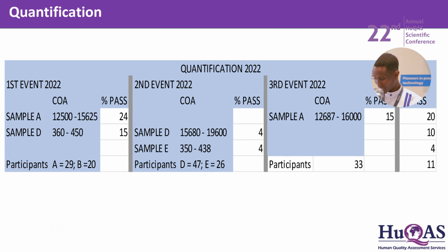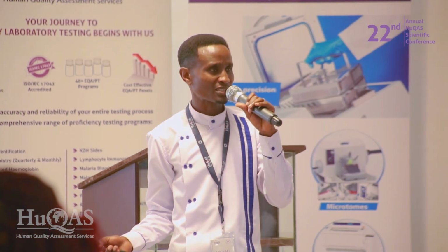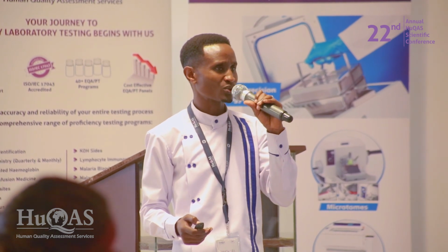So this is how we do the calculations. Once you use the thick film, you count parasites against WBCs, up to 200 WBCs. But if there are fewer than 10 parasites by the time you get to 200, increase the counts to make sure that your data is correct, or in other words, to increase your accuracy.